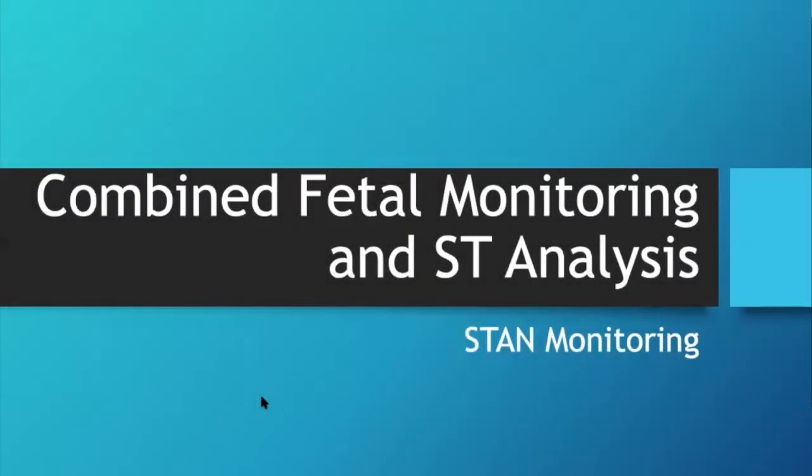So we're talking about ST monitoring. Yes, some of us have been using it for a while. Some of us have used it somewhere else. And we all know that the guideline is changing. So it's important to actually talk about the ST guideline and how this is going to affect us and affect our lives and affect our patients.